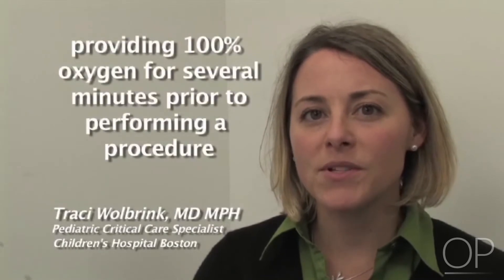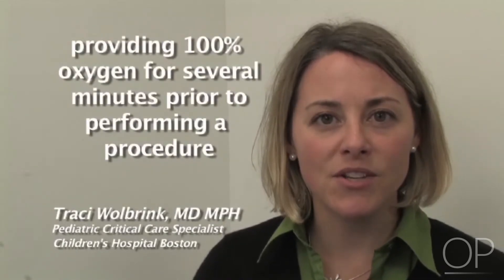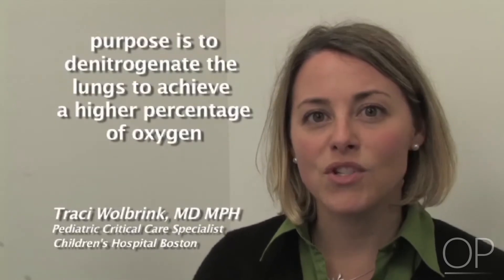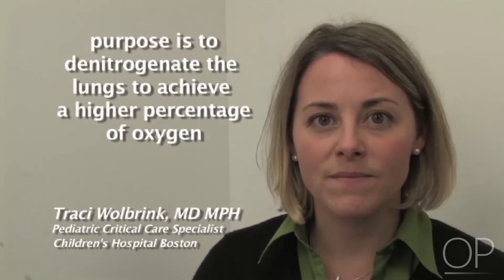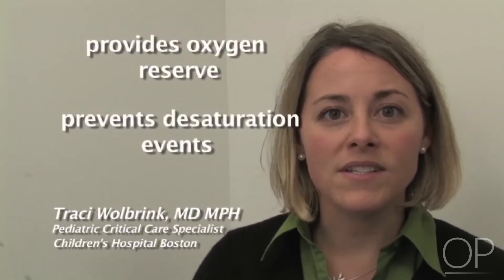Hyperoxygenation refers to the process of providing 100% oxygen to your patient for several minutes prior to performing a procedure, such as intubation or endotracheal tube suctioning. The purpose of hyperoxygenation is to denitrogenate the patient's lungs to achieve a higher percentage of oxygen, providing some reserve and preventing desaturation events while disconnecting the patient from the ventilator in order to perform endotracheal tube suctioning.